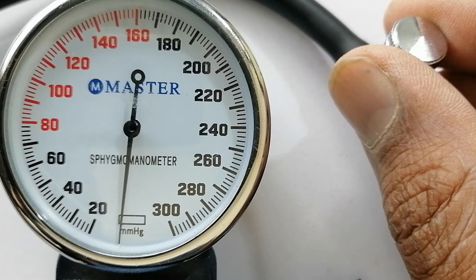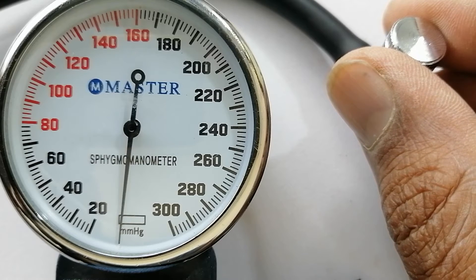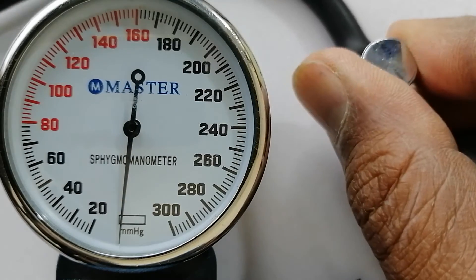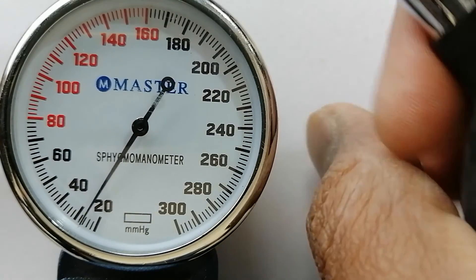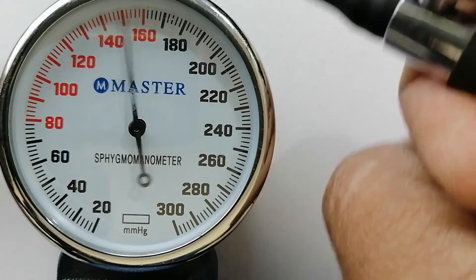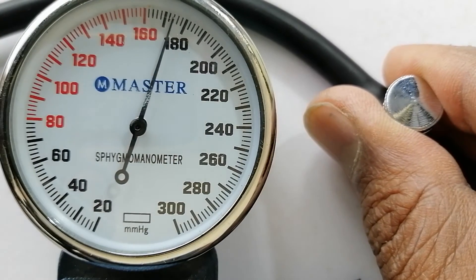Now I'm putting pressure on 180. After that I will release the pressure. You have to take note of when the sound of the pulse comes to you — pay attention to your ears. I have closed the valve completely, and now I'm starting to fill the air. Now let me loosen the valve a bit.